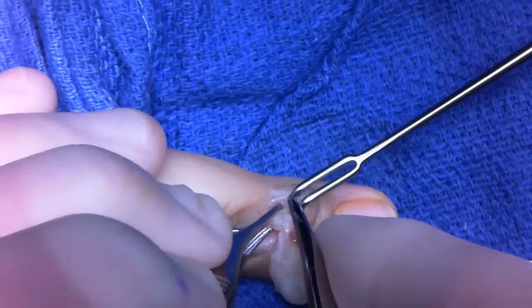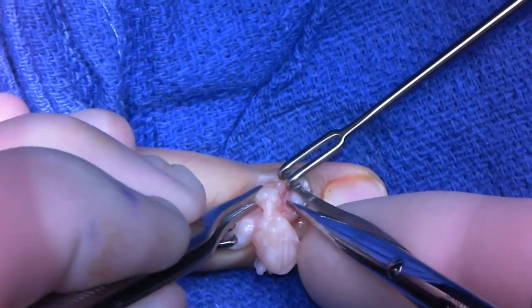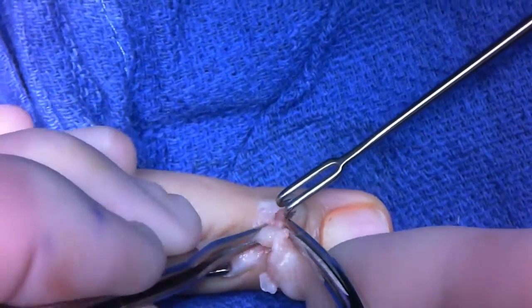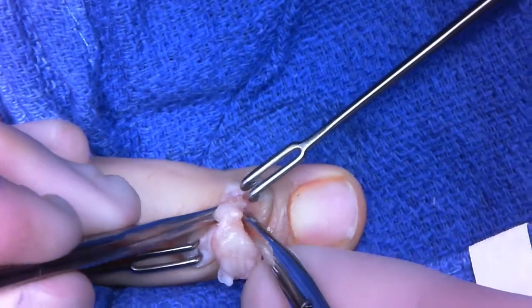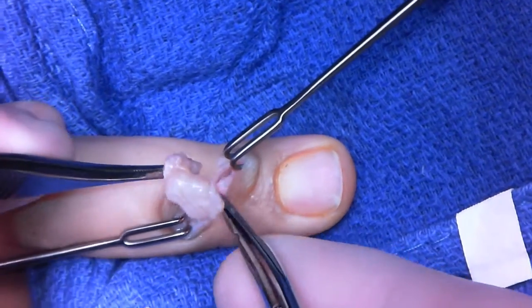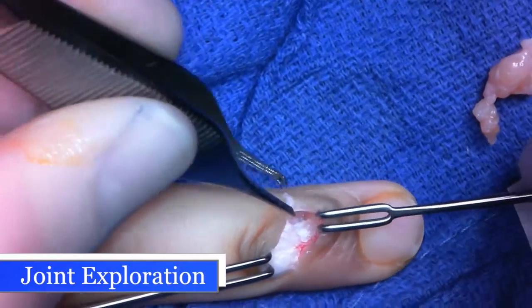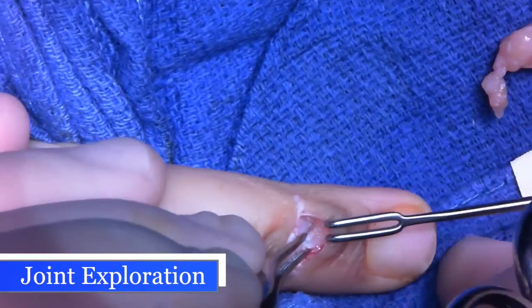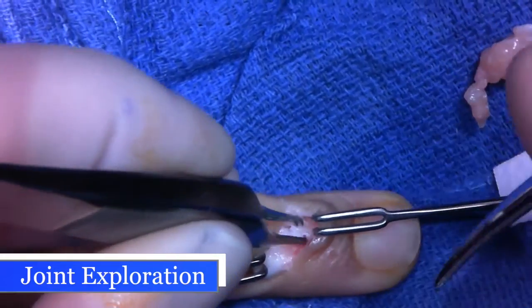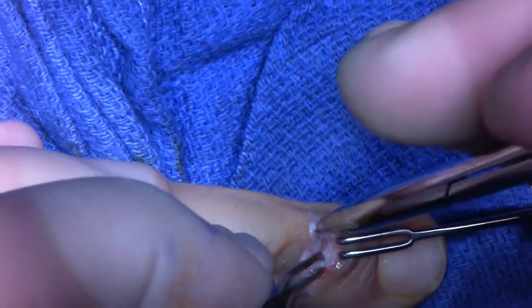See the last bit of tumor that's going down into the joint. Now exposing the DIP joint, moving the joint, looking at the articulation with no further tumor.